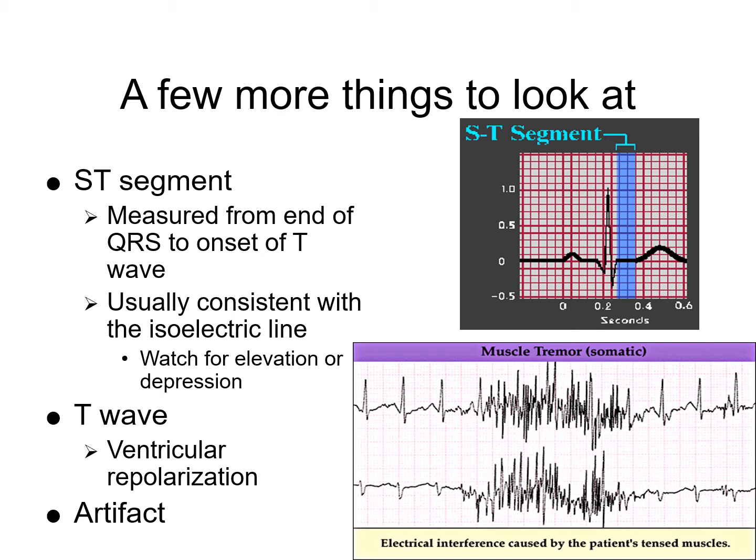Right now actually, because I'm looking at my notes. Your T wave can sometimes vary. You could have a high or tall T wave that could represent electrolyte imbalance. An ST depression, going down, is ischemia. If that ST line is not isoelectric and it goes below the isoelectric line, then it's more indicative of ischemia, which is not as bad as an elevation. An elevation is an MI, myocardial infarction.